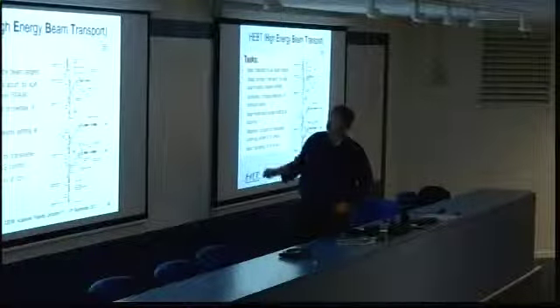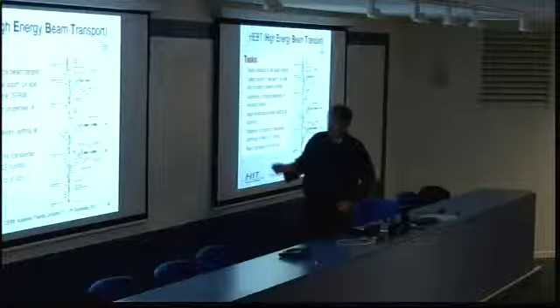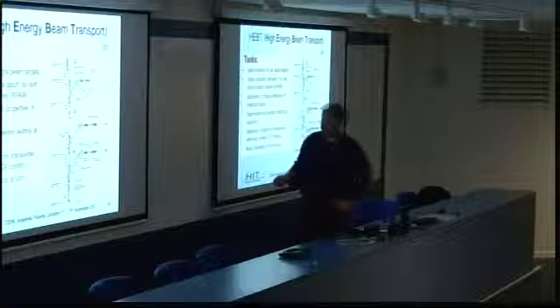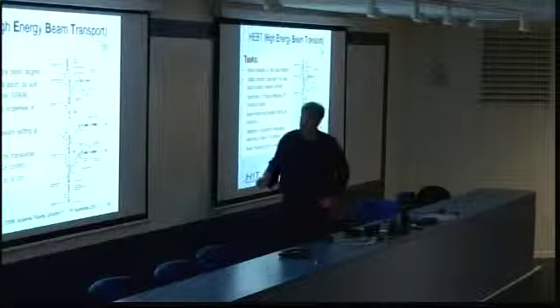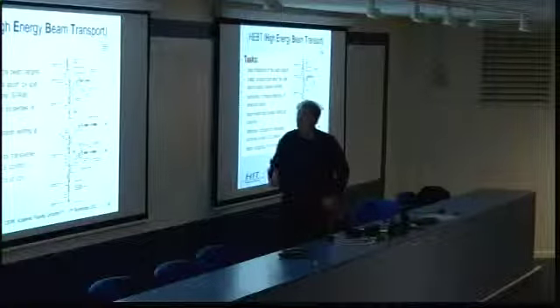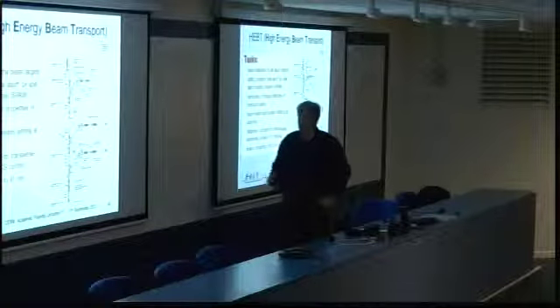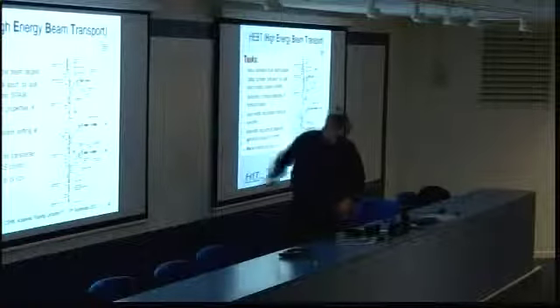So what we have to do here is to bring the beam clearly to these target stations. We need the safety function to switch off the beam in case of an interlock from the target stations as fast as possible. I will come to that. We have to verify the beam properties of the extracted beam, and what we have to adapt is the beam width and position setting at the ISO center. These are the target station positions here.